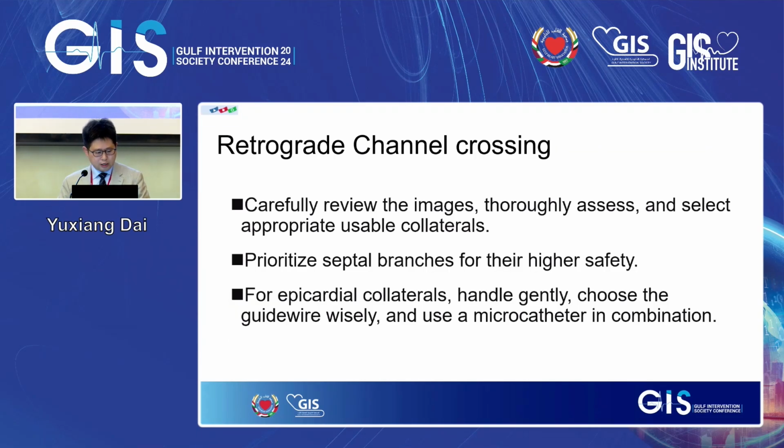It's quite good, and you can see retrograde channel crossing, even for very tortuous epicardial collateral, can be achieved by very gentle handling to cross the collateral.